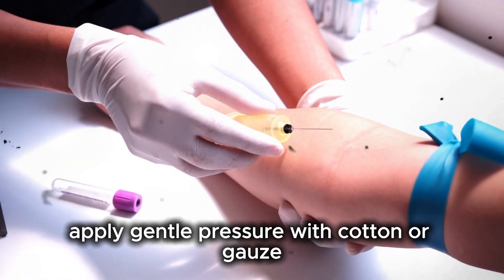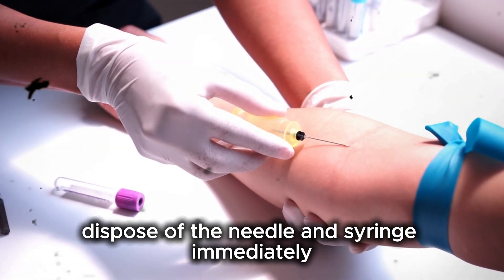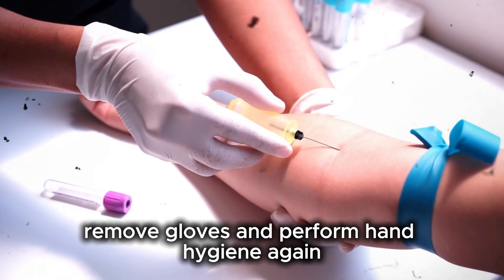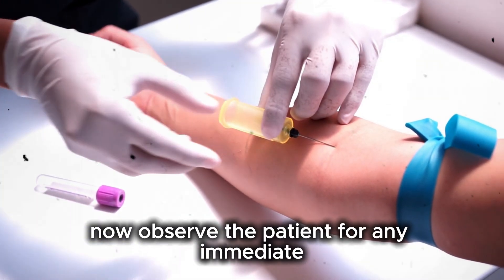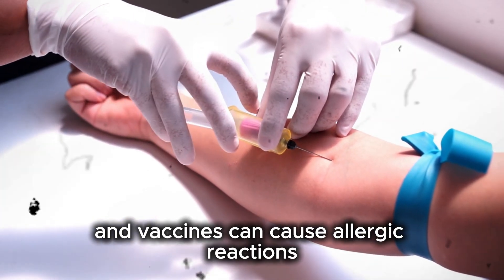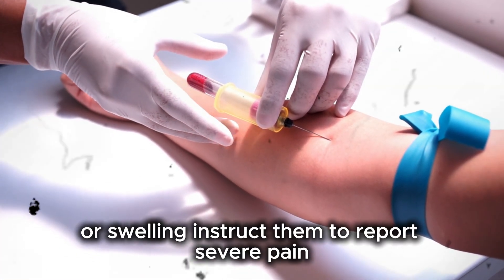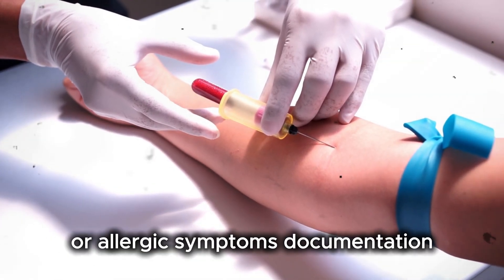Apply gentle pressure with cotton or gauze. Do not massage the site unless indicated. Dispose of the needle and syringe immediately into a sharps container. Never recap the needle. Remove gloves and perform hand hygiene again. Now observe the patient for any immediate adverse reactions, as some medications and vaccines can cause allergic reactions. Advise the patient about possible side effects like pain, redness, or swelling, and instruct them to report severe pain, numbness, fever, or allergic symptoms.